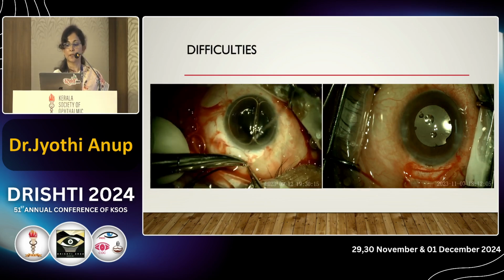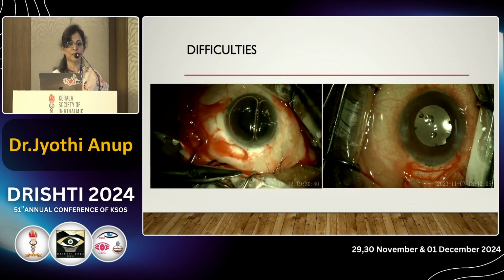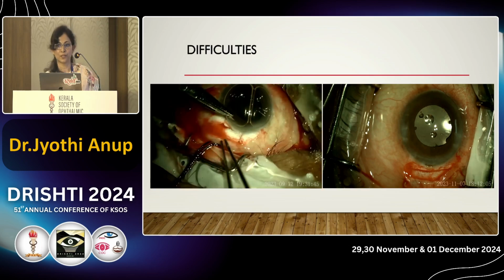So, this is the difference between a planned conversion and an unplanned one. You may still have to suture, don't hesitate to suture. So, this is where the initial steps, the good suture practice, is also needed for a sutureless surgeon.